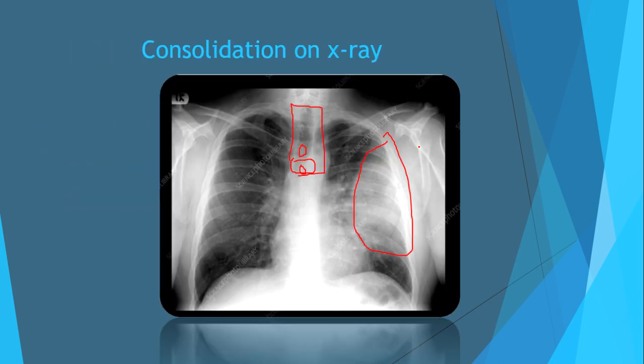Artifacts. Sometimes we can see some artifacts. It means some detail which disturbs the picture. Maybe sometimes it's metal in the nipples or in the bones. This structure cannot help us lead to the diagnosis, so we must re-examine our patient.